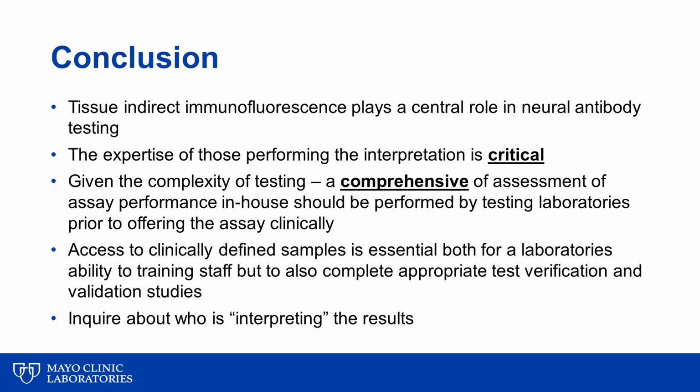In conclusion, tissue indirect immunofluorescence plays a central role in neural antibody testing. The expertise of those performing the interpretation of these assays is critical. Given the complexity of testing, a comprehensive assessment of assay performance in-house should be performed by the testing laboratories prior to offering these assays clinically. Laboratories should not depend on performance claims by the manufacturer and only utilize a limited number of samples to ensure that they're performing the assays properly.